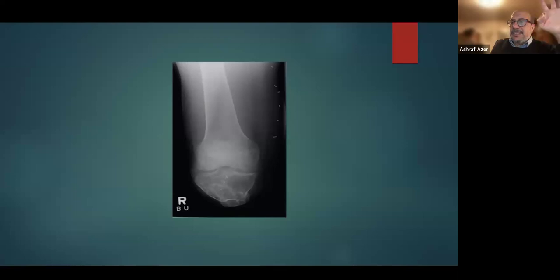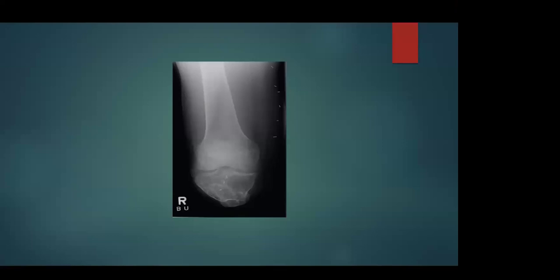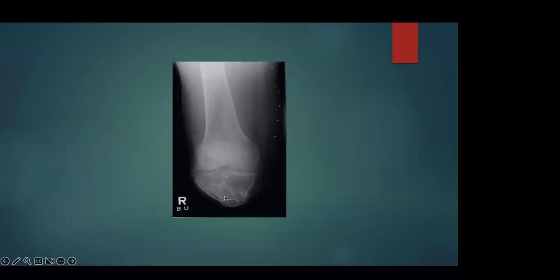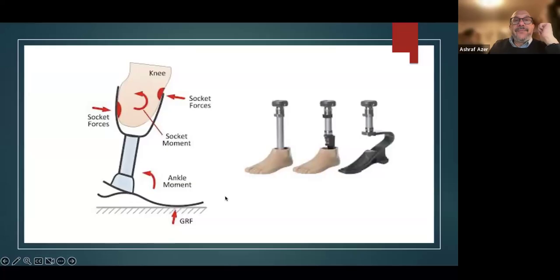Is that clear? How can we do that? Should we reroute them in the muscles or in the tibia? In the bone. The tibia. But ideally, you should go through the knee. It will be easier because this is a non-functional part. Why is that? I'm going to explain it now.